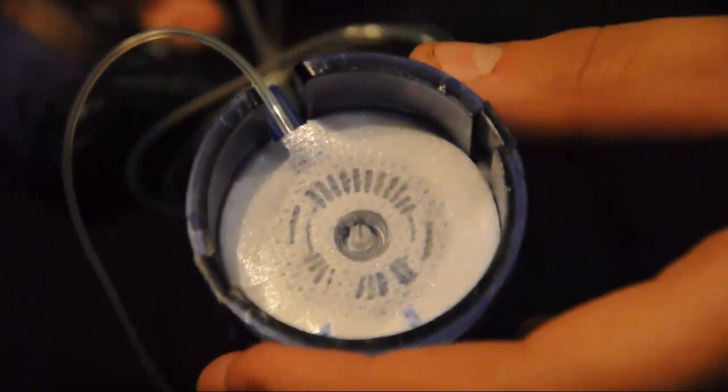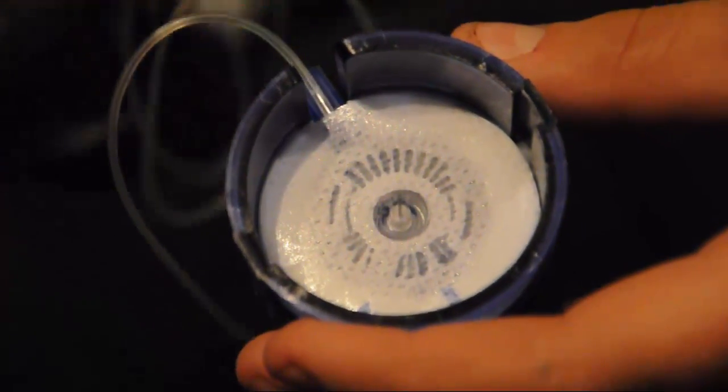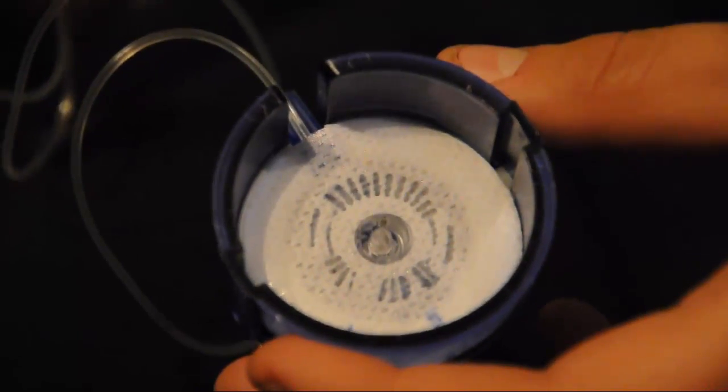Now I have to make sure drops are coming out the end, so I just need to hold the act button and it beeps. And that means it's reached the end of the reservoir. So now it's just pushing it to make sure, and then soon you should see drops coming out the end, which means that it's ready.